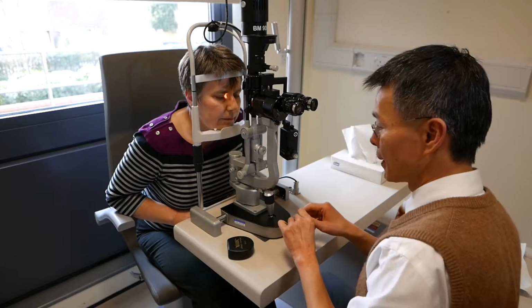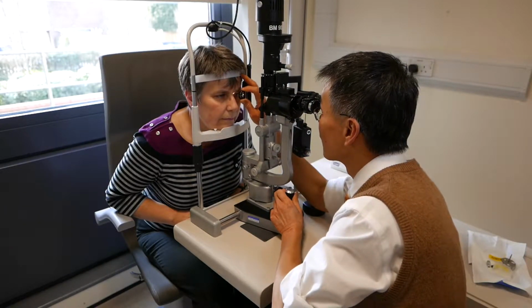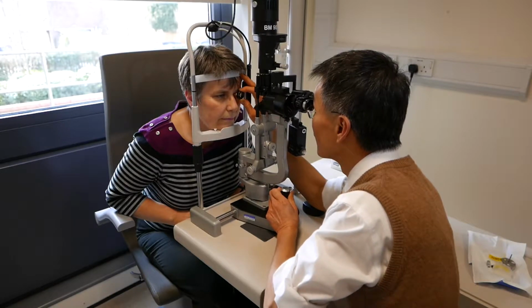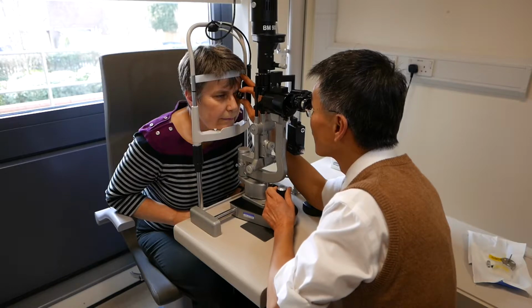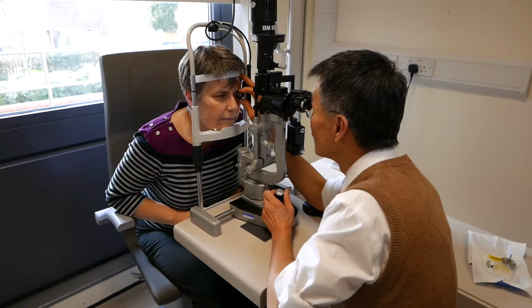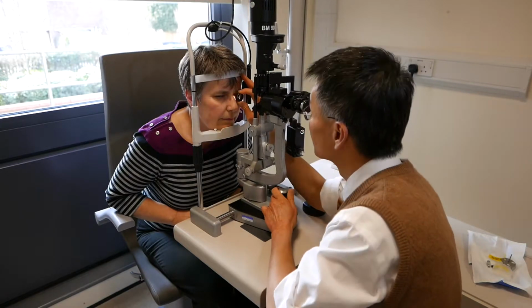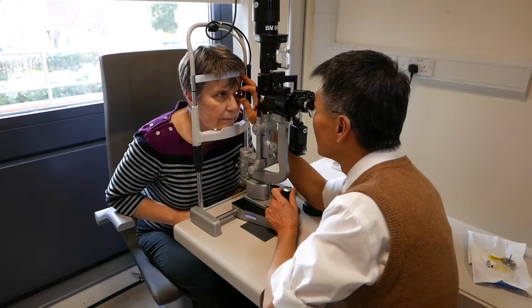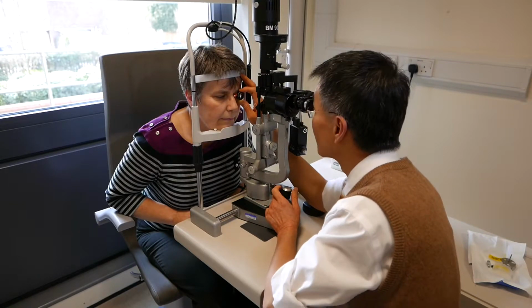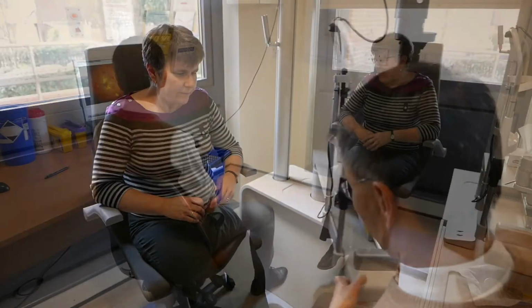I'm just going to have a look at the other side now. Again, look straight ahead for me. Look to your left. And to your right. And look up. And look down. Okay, that's fine. Sit back now. Thank you.